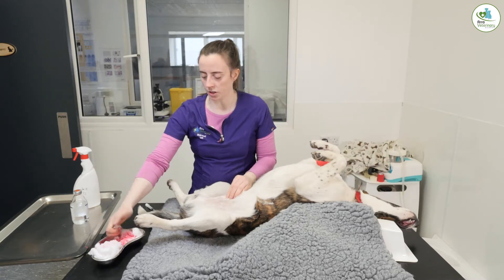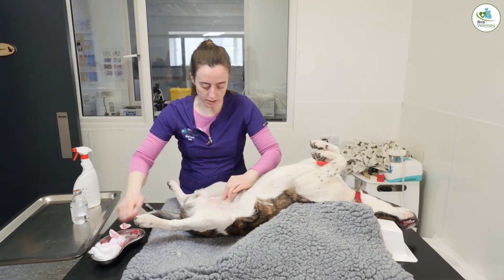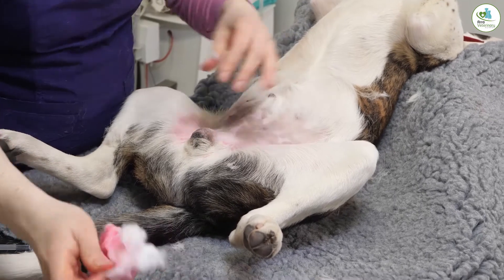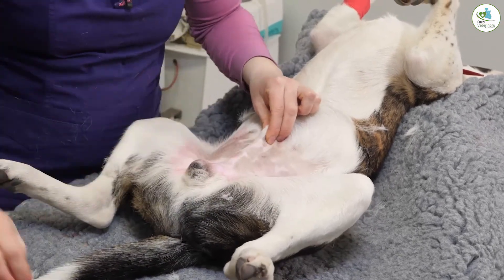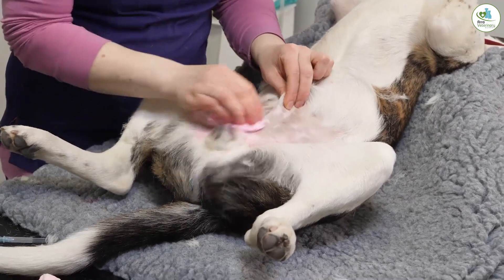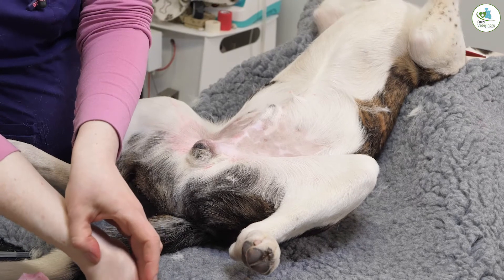When you're doing a surgical scrub, you start on your incision site and then work outward — never put the dirty cotton wool back into your incision site again, so that you're always using the clean bit for the incision site. Covey is nice and clean actually, which is good. You always want to clean the actual wound area first so that you're not introducing any dirt back into it. If you cleaned out here first and then brought your dirty cotton wool in, you'd be putting dirt and bacteria straight back into the incision site, which we don't want. We want a clean sterile site to start with so that we don't introduce any infection.